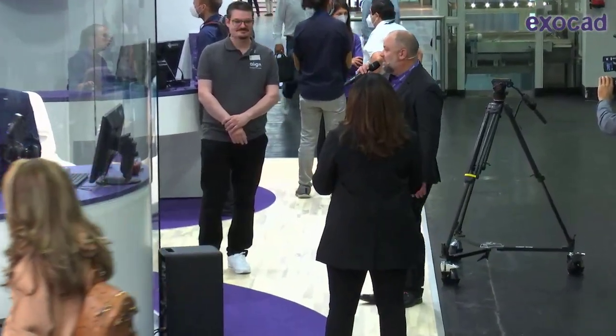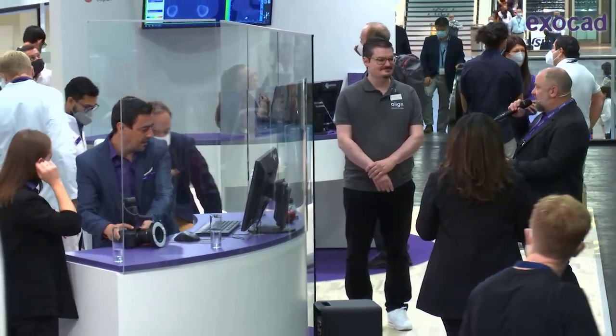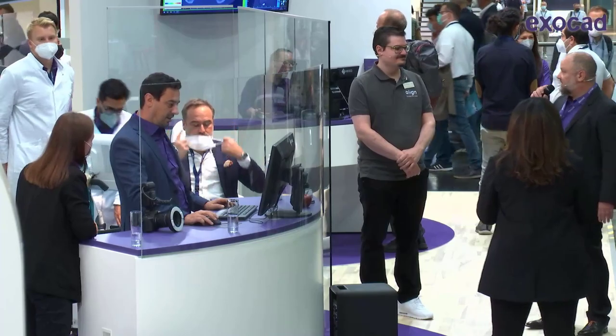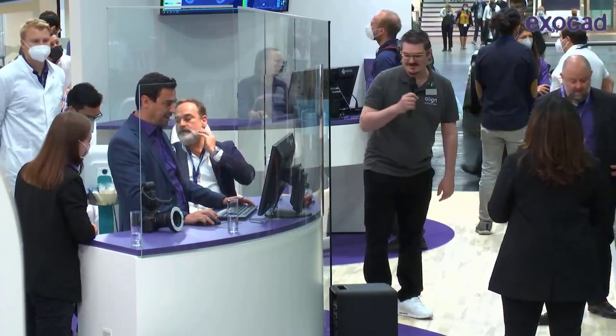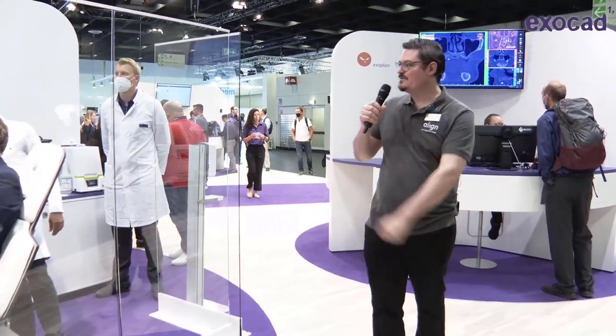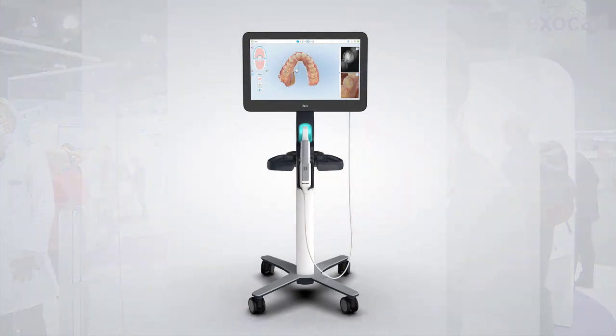Now we are seating the patient into the dentist's chair, and I hand over my microphone to my colleague from Align, who will explain the scanning process. Welcome everybody — as you can see, our patient is ready. We are working today with the iTero Element Plus in a 5G configuration.